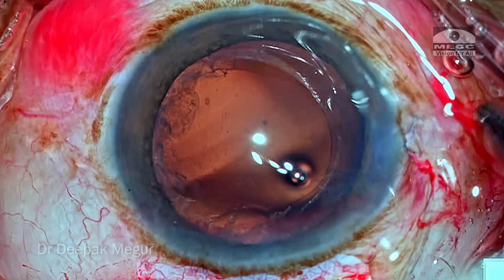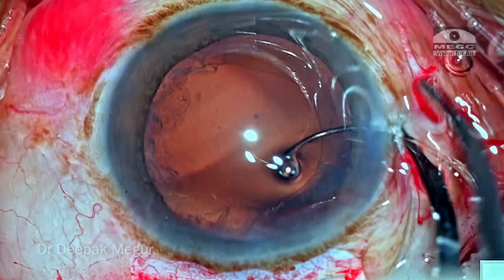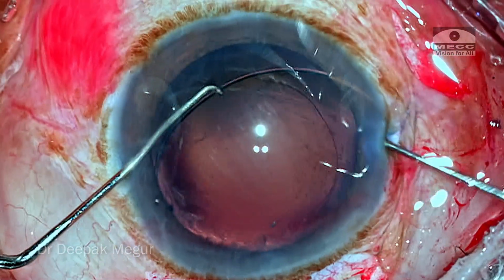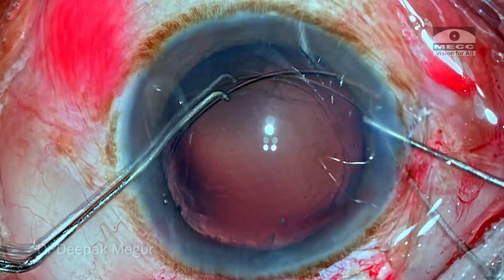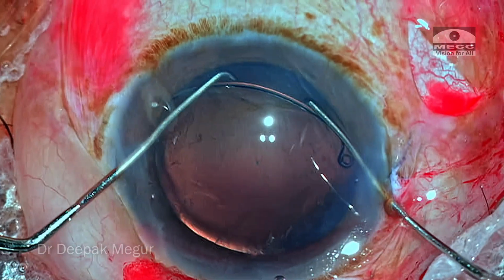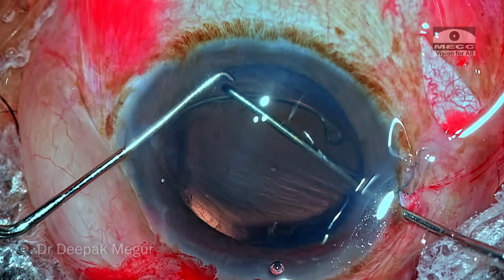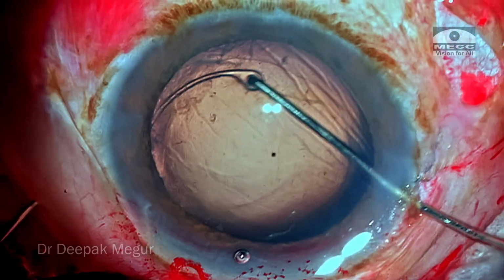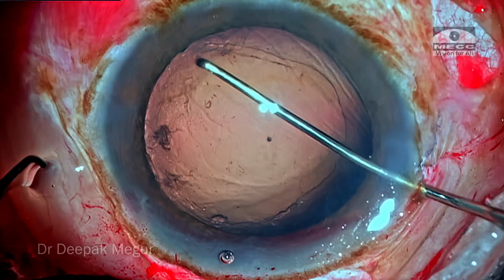Let me share with you an experience of a resident surgeon who is implanting probably his first or second CTR in a case which has an intraoperative complication of localized zonular dehiscence. So let's see the video and try to understand what the beginner surgeon experiences while handling a CTR and the problems they face while inserting the ring.